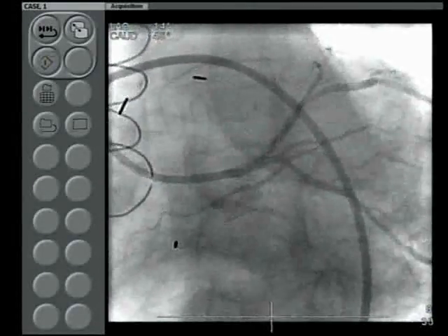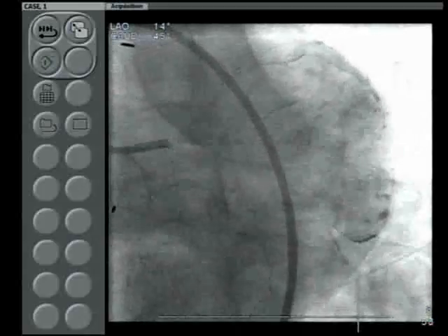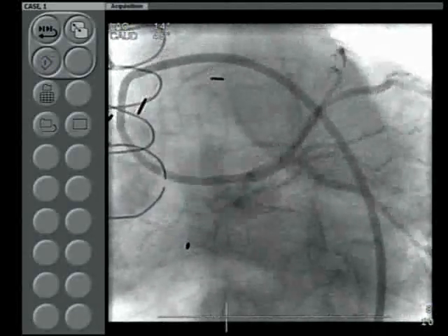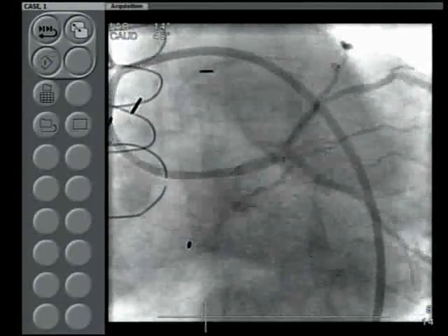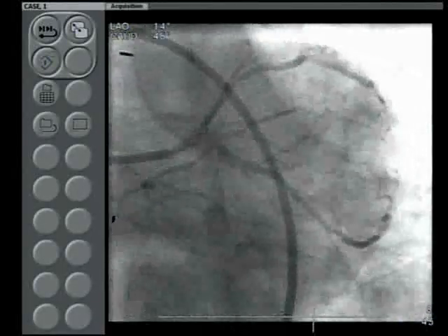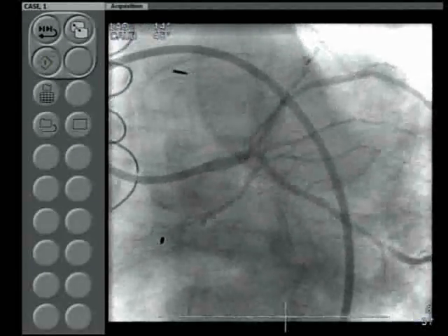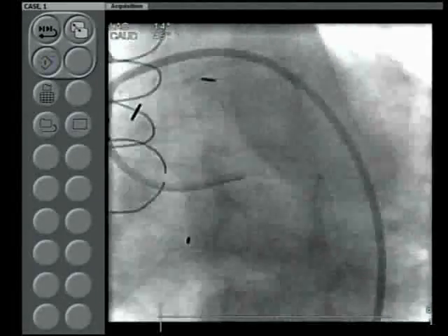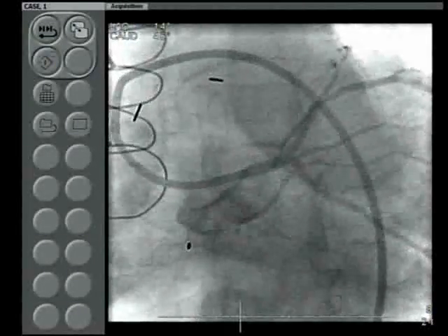But very important, those two OMs are gone, and whatever we call the OM or LPL has significant disease further down. This is what I think angiographic analysis would be, and then there's a major diagonal again with ostial disease. Samin, a little surprising that with the patent LIMA to the LAD there is still marked anterior wall ischemia. Yeah, I think it's largely because of that big diagonal.